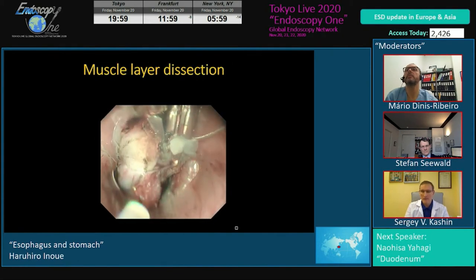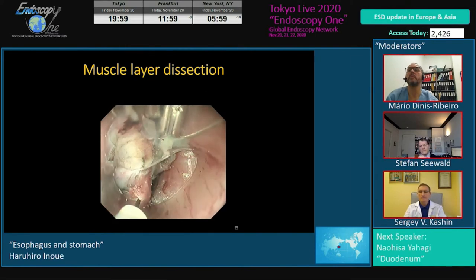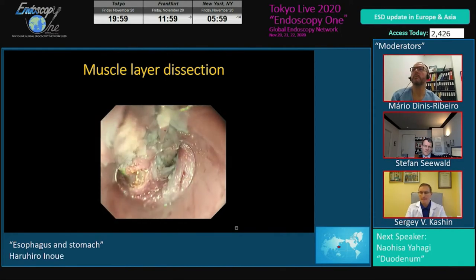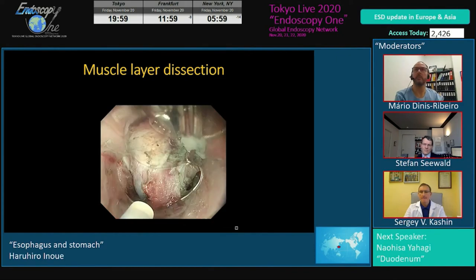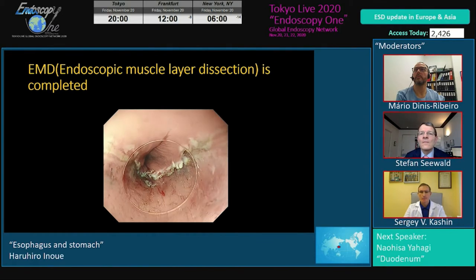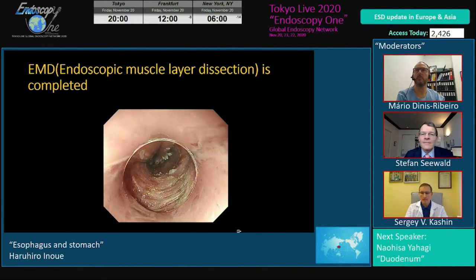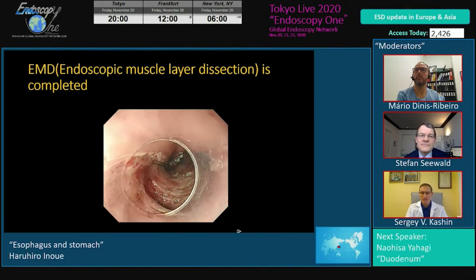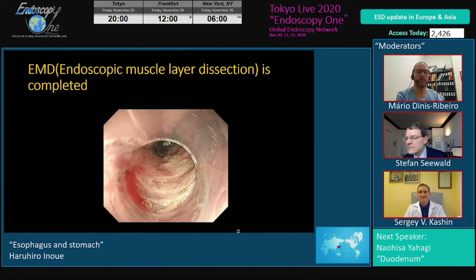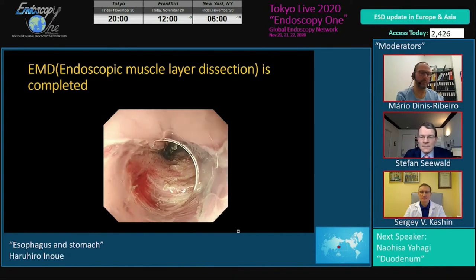So carefully dissect the muscle without making injury to the tumor itself. Then finally, we can resect the remnant tumor like this. There is bleeding at the left side bleeding point. This area is a muscle defect. But fortunately, our muscle defect is still limited to the circular muscle layer.